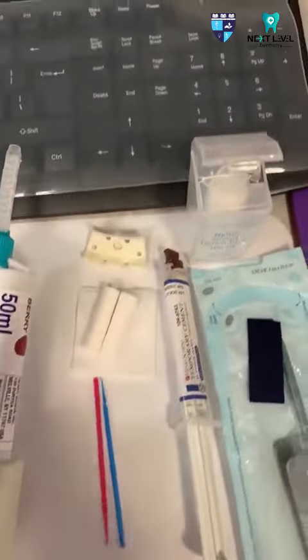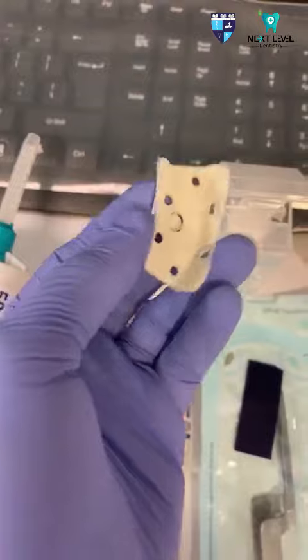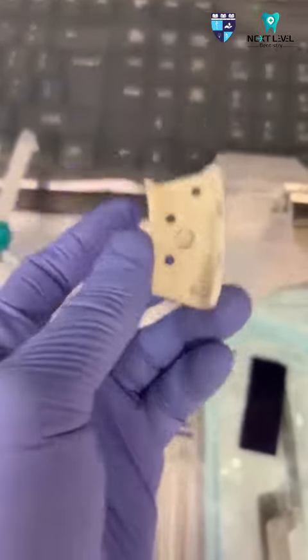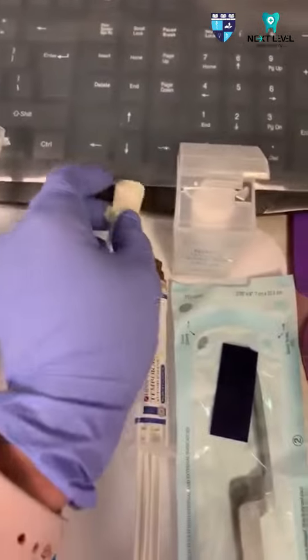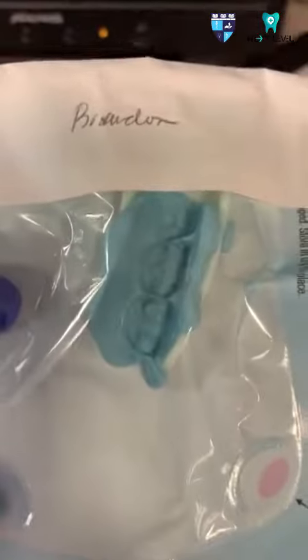In doing a temporary crown, before the doctor preps, the assistant should put a bite registration material on this small tray and let the patient bite. And here is a bite registration taken from a certain patient.